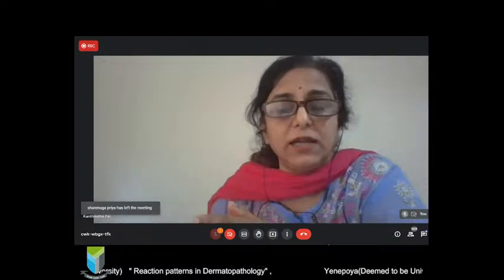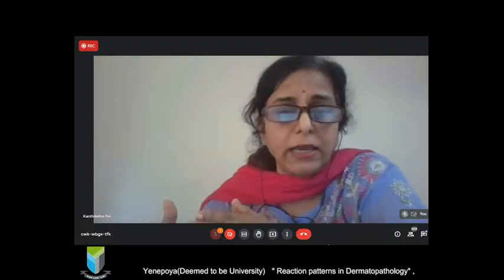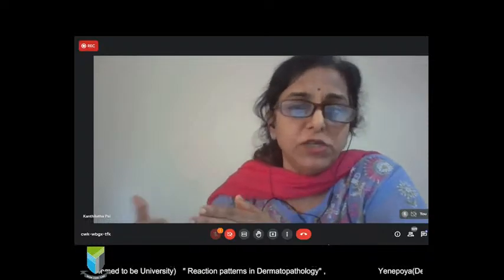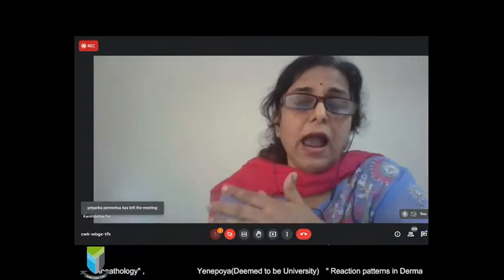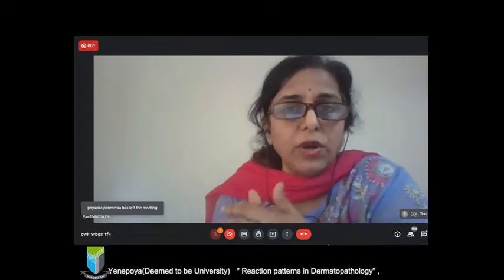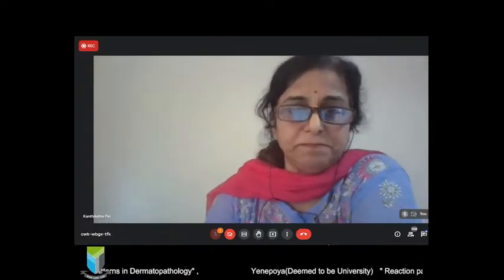If it is mostly in the dermis, then it may be leprosy, or the algorithmic approach is totally different, which I'm not dealing with today. So if we are mostly seeing the epidermal changes, look carefully and look at any of these reaction patterns.